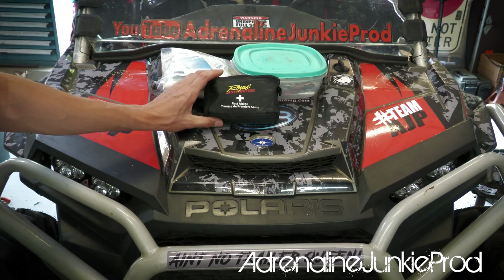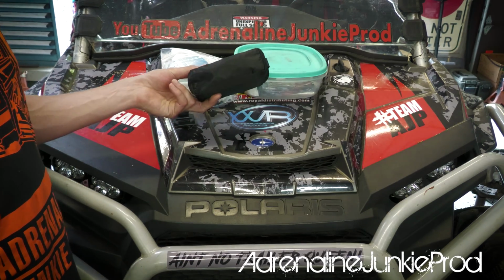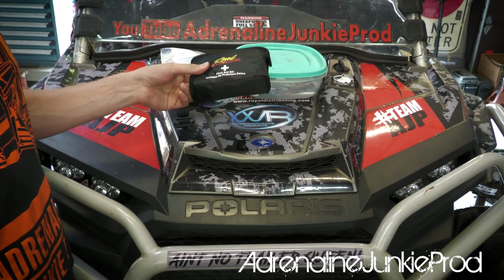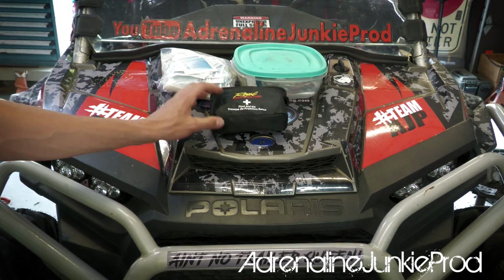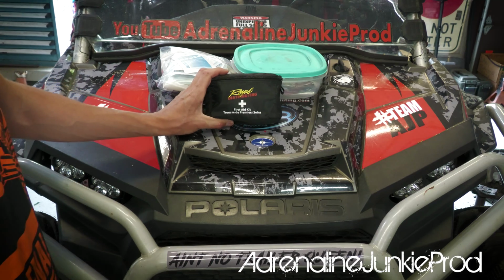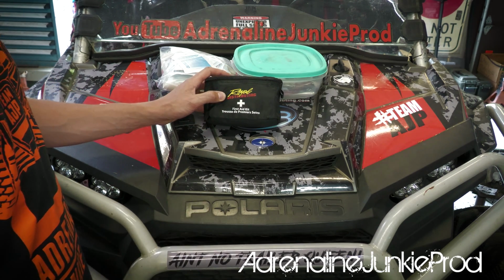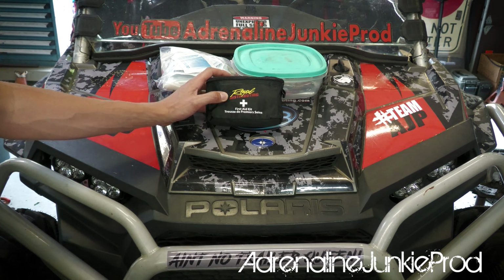This is a pre-assembled kit from Royal Distributing. It's one of their deluxe first aid kits. Any power sports store, any outdoor store, pretty much any big box store will sell some sort of pre-made first aid kit. One thing to keep in mind is a lot of these first aid kits will base their quality on the number of items inside of it, but keep in mind that some of the cheaper first aid kits will say they have 400 items in them and they're $20, but 50 of those are alcohol wipes.